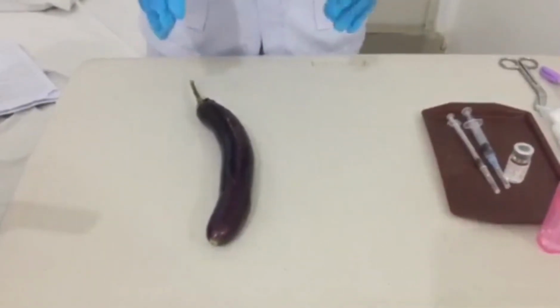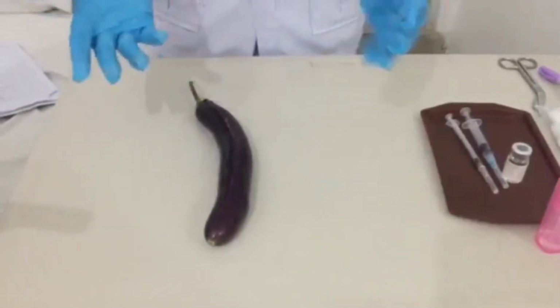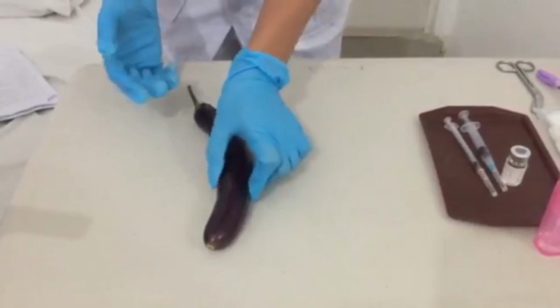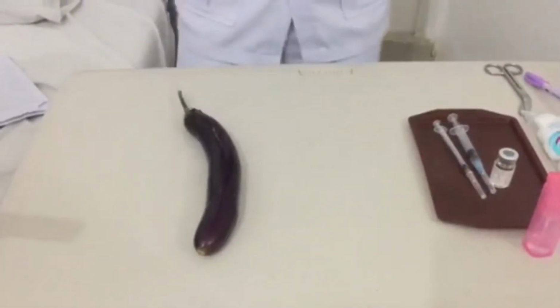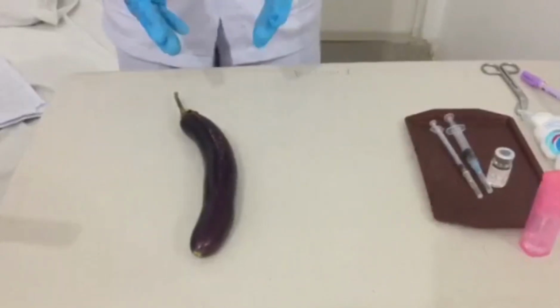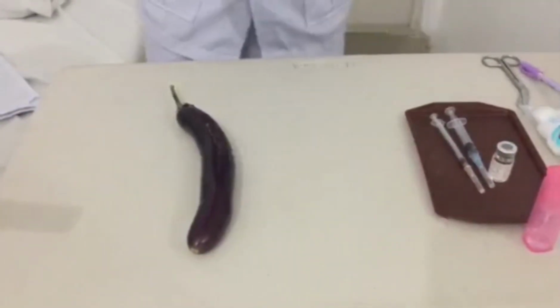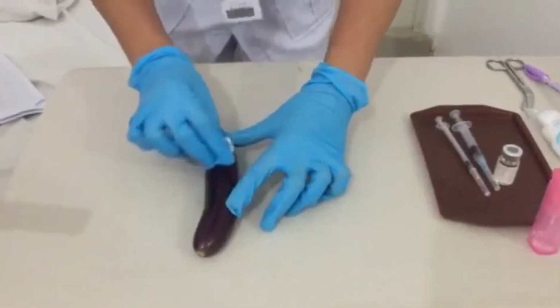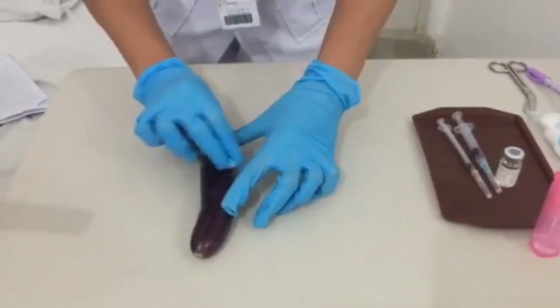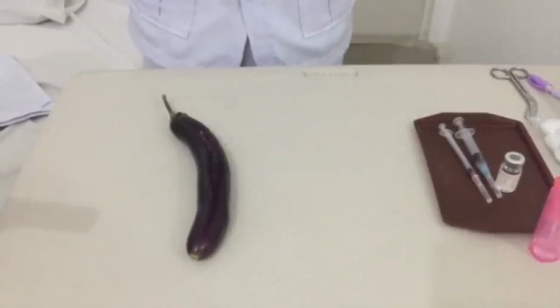So I will locate the exact site for the injection, and since I've already put on my gloves, this will be my injection site. So now, I will clean the site with an antiseptic swab using a circular motion. Start at the center and move outward about 5 cm or 2 inches. And then transfer and hold the swab between the third and fourth finger.